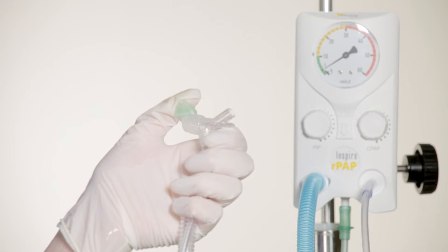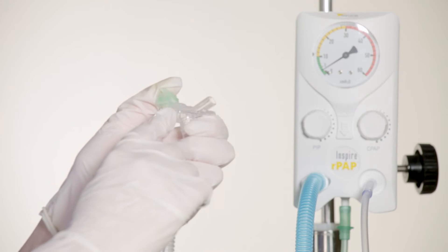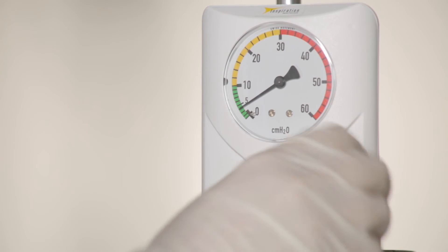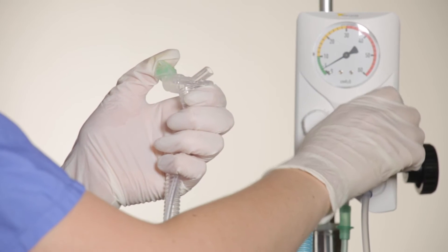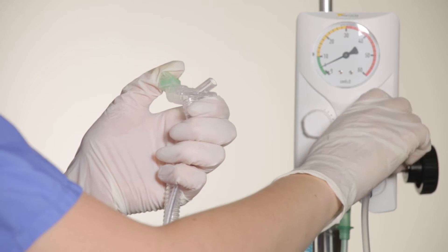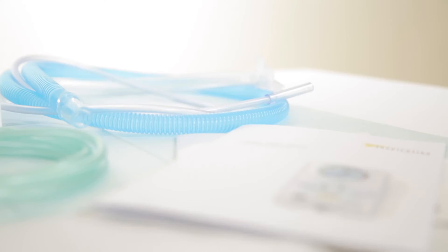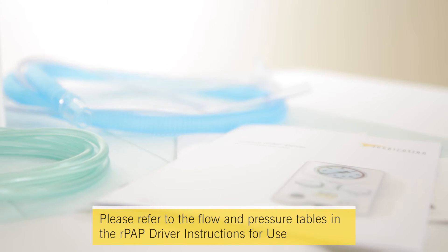The final step is to set the CPAP. To do this, occlude the nasal prong interface and turn the CPAP control knob until the desired CPAP level is achieved. Please note, a flow rate of 12 litres per minute will supply 4 litres per minute to the PIP line and 8 litres per minute to the CPAP line, generating a CPAP of approximately 5cm of water. Please refer to the flow and pressure tables in the RPAP driver instructions for use to set the prescribed pressure for the infant.